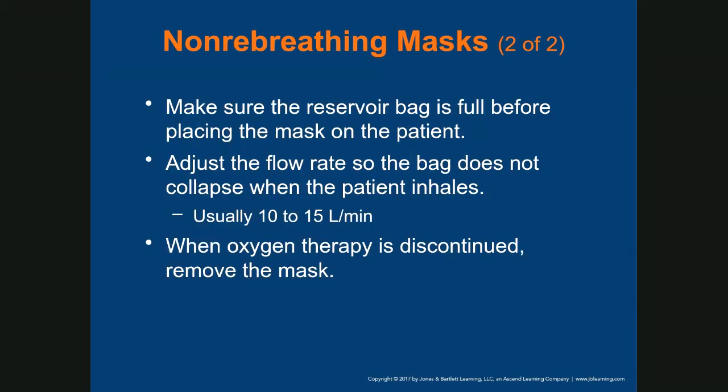With the non-rebreather mask, make sure the reservoir bag is full before placing the mask on the patient. Remember what I said, anything below 10 will not effectively inflate that bag. So 10, 12, 15 liters per minute. Adjust the flow rate so the bag does not collapse when the patient inhales.